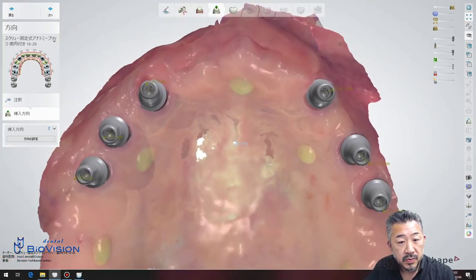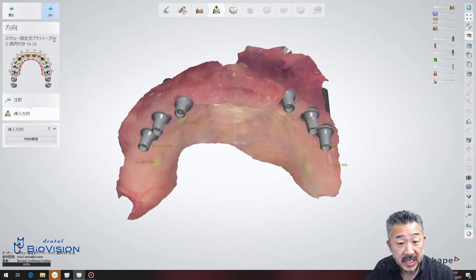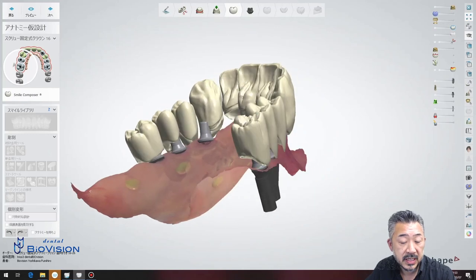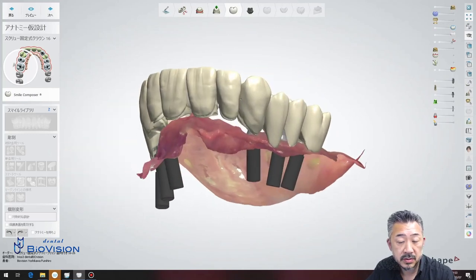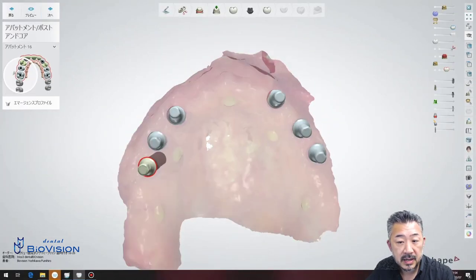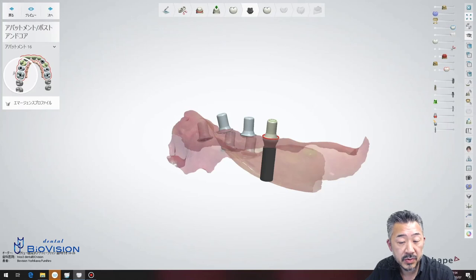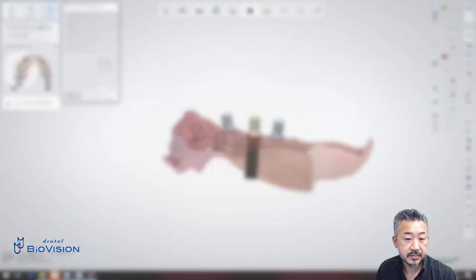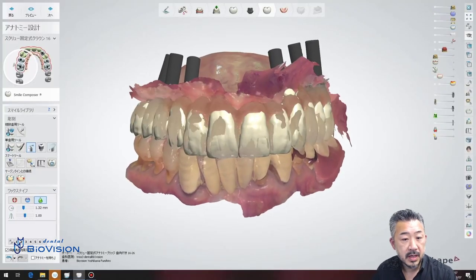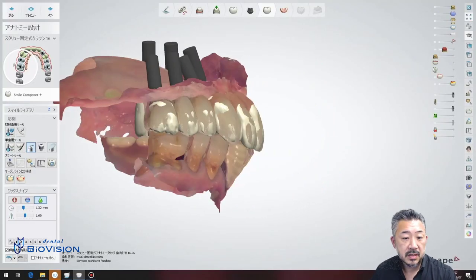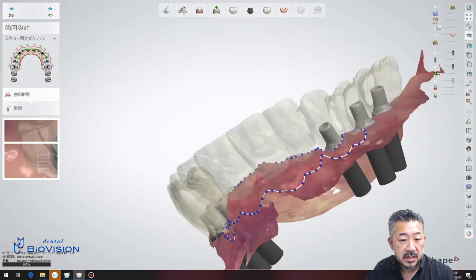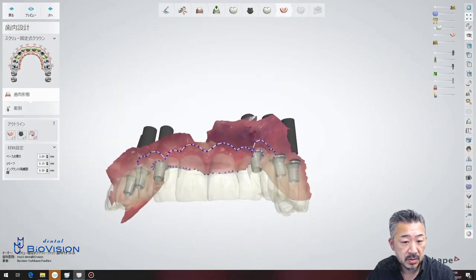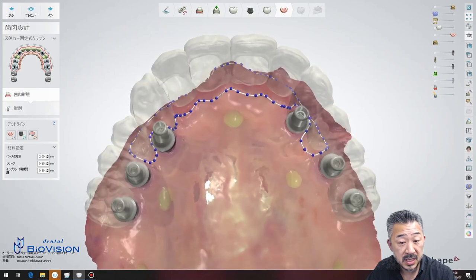From here I will design each tooth. Select the appropriate shaped teeth from the teeth library in Smile Composer and arrange them based on the provisional data. Next, set the outline in the gingiva form and design the gingiva. Now you can see the outline.